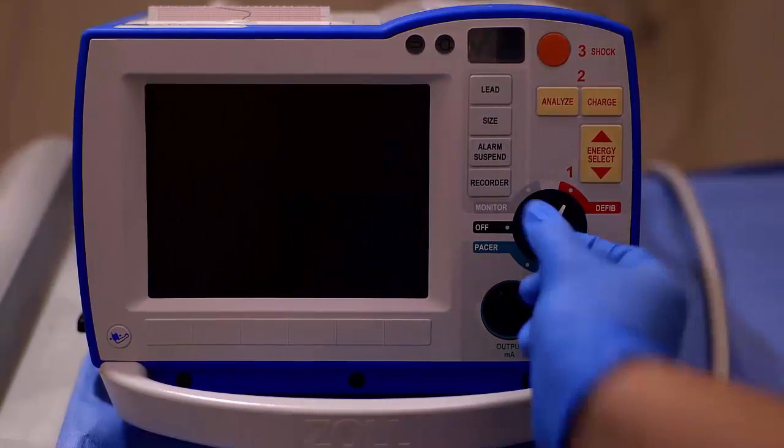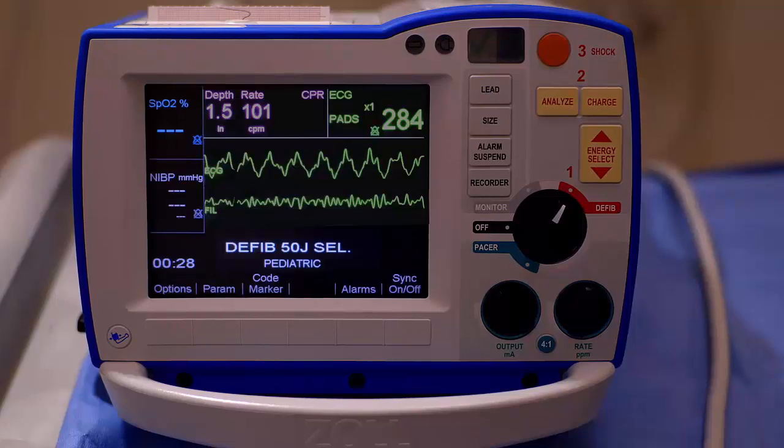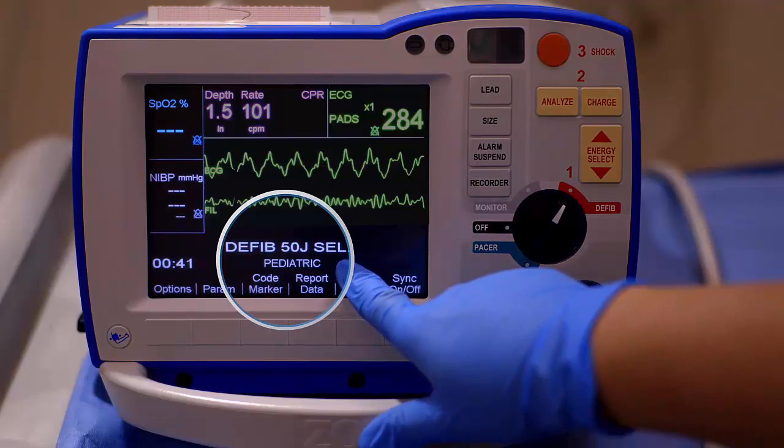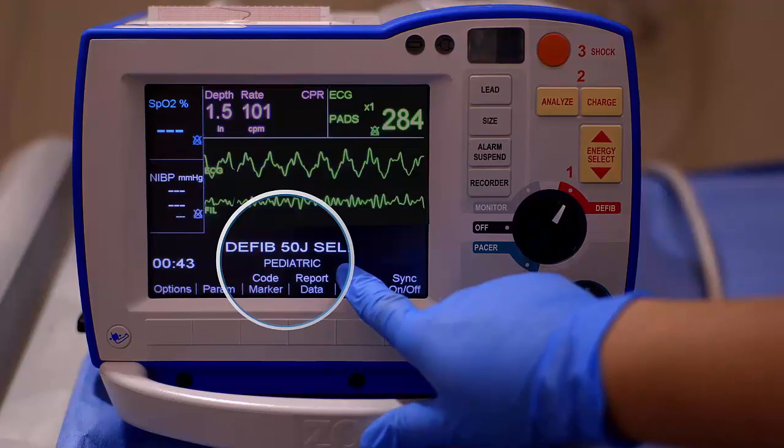For pediatric patients less than 8 years of age and less than 55 pounds, one-step pediatric electrodes with and without CPR can be used to maximize the R-Series pediatric capabilities. When connected, the R-Series defibrillator will automatically lower the energy level to 50 joules, adjust its AED analysis algorithm to pediatric parameters, and display compression rate and depth on the CPR dashboard and filter compression artifact from the ECG waveform.